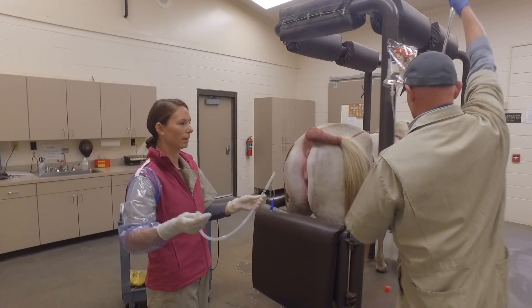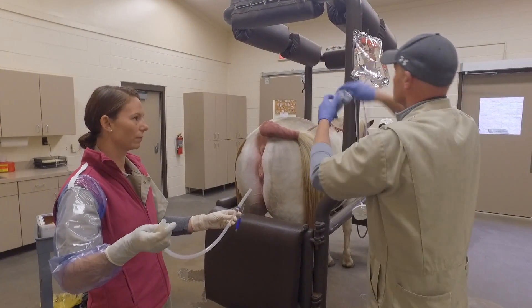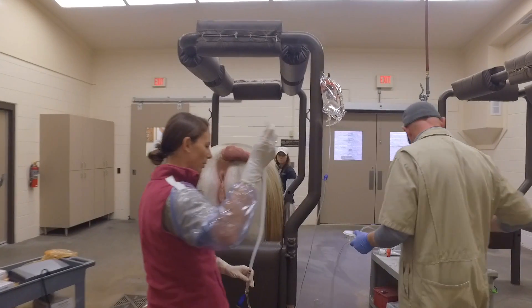We'll go ahead and attach our Y-piece to our Bovona catheter and run some fluid through it, making sure our cuff is also working prior to placing the catheter into the mare. Our line is primed.